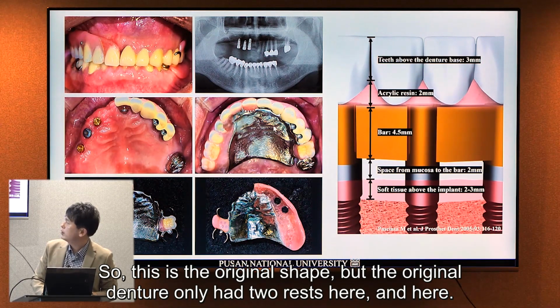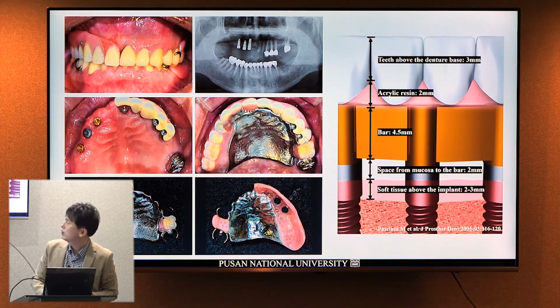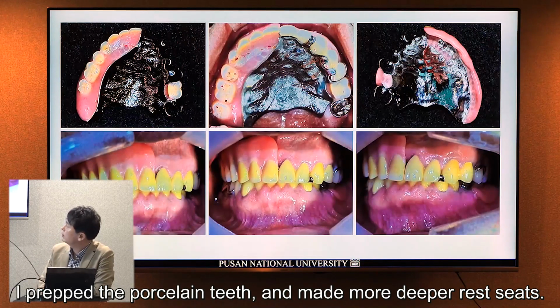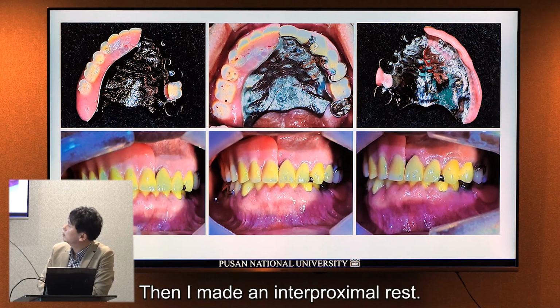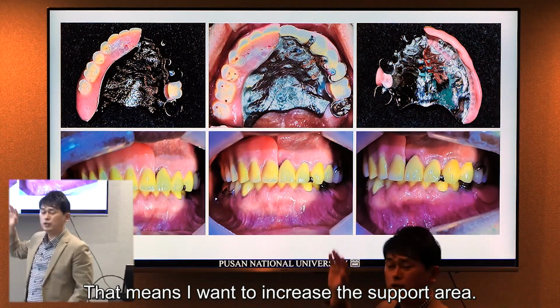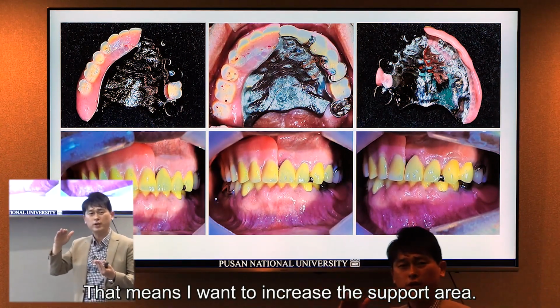The original denture had only 2 rests, here and here. I prepped the porcelain teeth, made deeper rest seats, and then made the interproximal rests. That means I want to increase the support area.